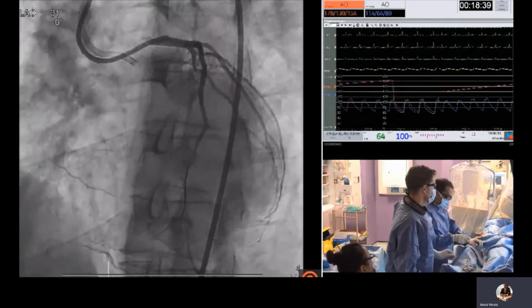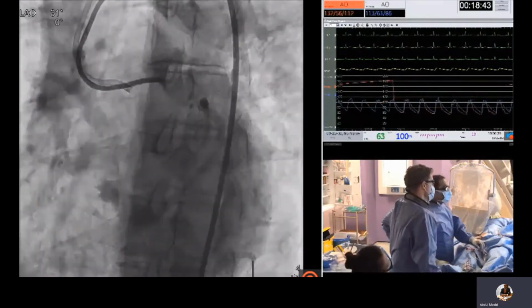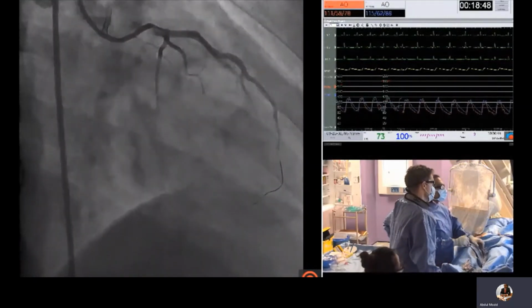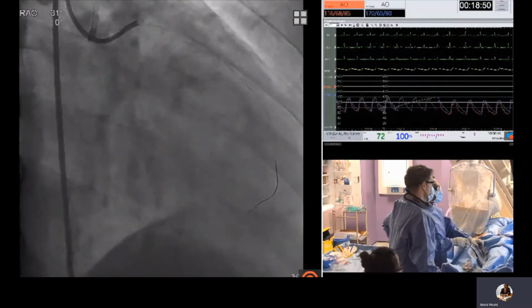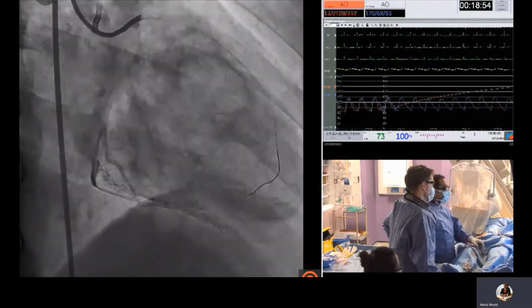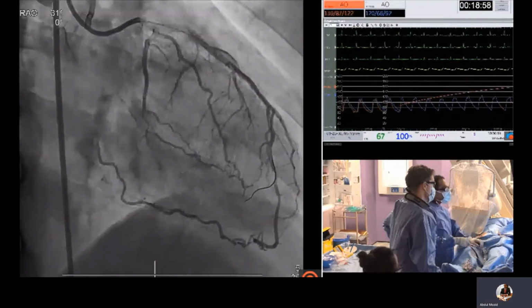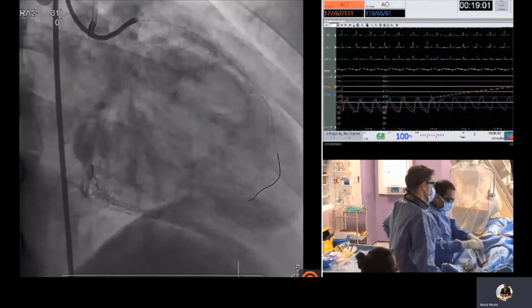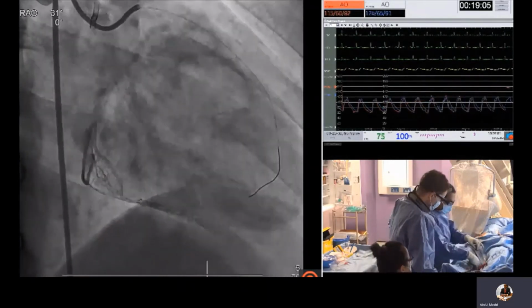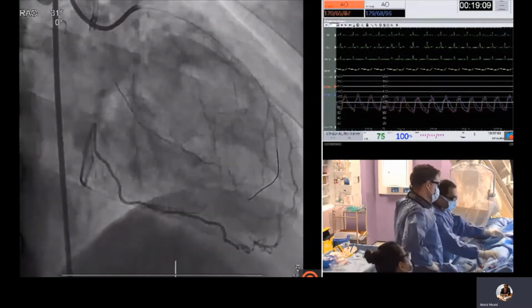This procedure was performed with left radial artery access. The right radial was occluded from the previous attempt, so he had right femoral artery access for the second access. These are his images from the left coronary, again confirming a dominant apical collateral from the LAD. There is also a distal septal, which appears to have an epicardial course and connects to an RV high marginal branch. There don't appear to be clear septal connections.